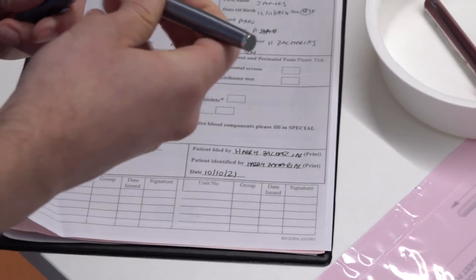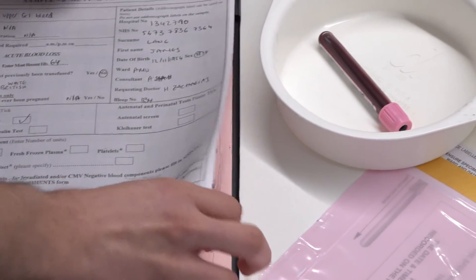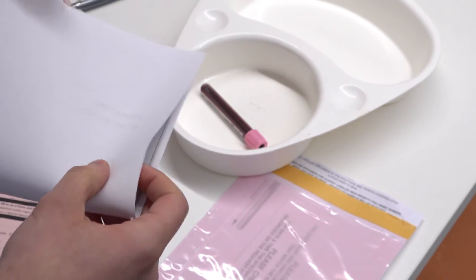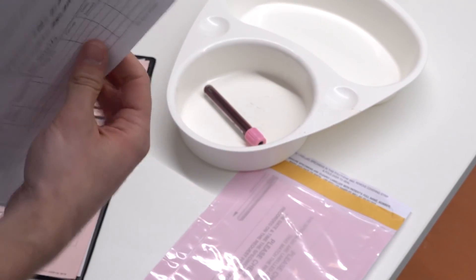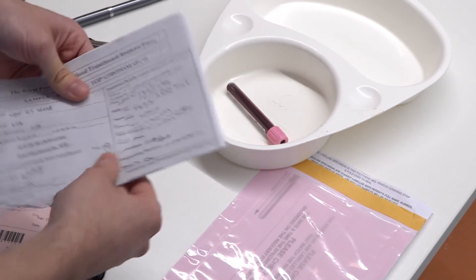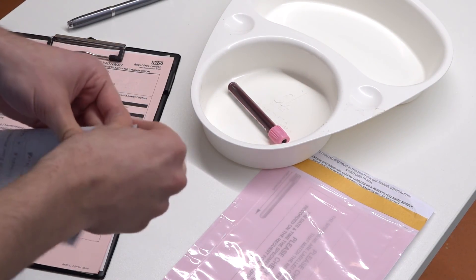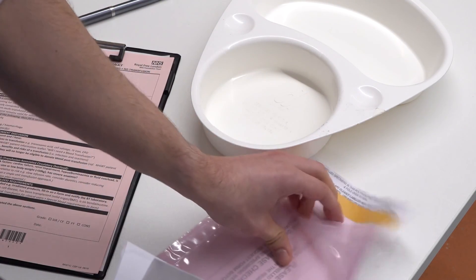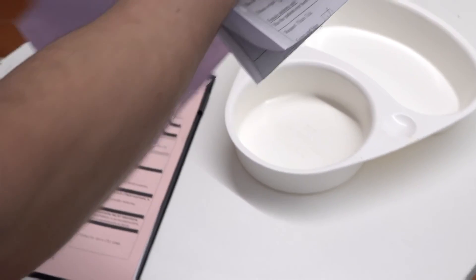If the patient does not have a previous valid group and screen result, the lab may require a second sample to confirm the blood group. The process of taking this second sample differs between trusts. For example, some trusts require a different person to take the second sample and/or the second sample to be taken 30 minutes after the previous sample. Please check local guidelines.